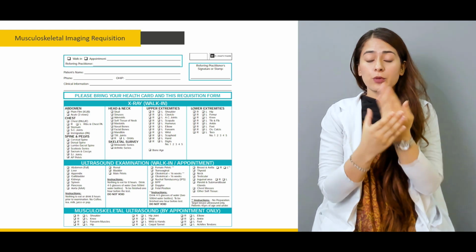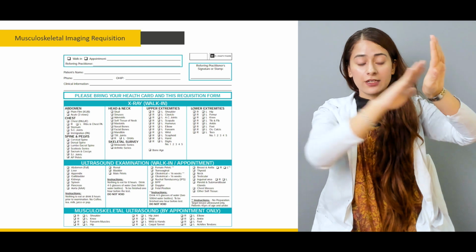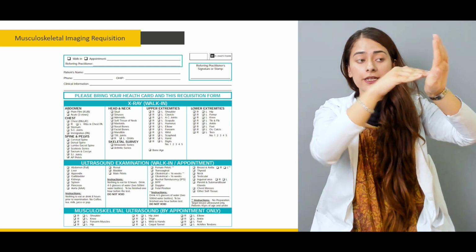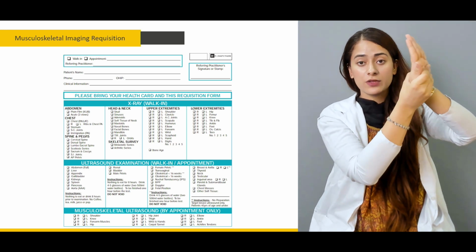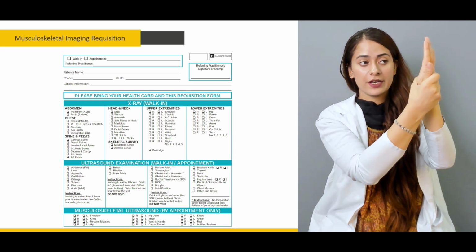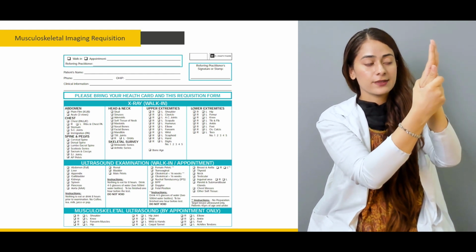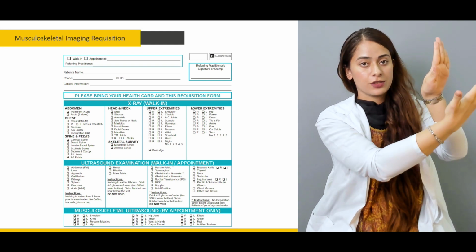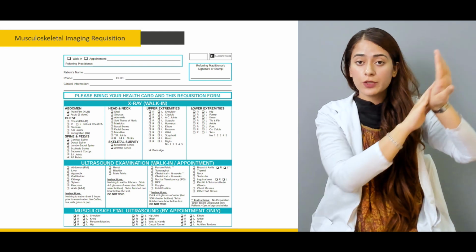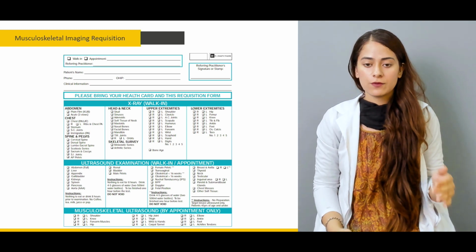If the posterior surface of my hand is facing the X-ray generator, then the X-rays will first enter from the posterior side of my body segment, my hand in this example, exit my anterior surface and fall on the bucky. So this will make a posterior anterior view, which is the PA view.